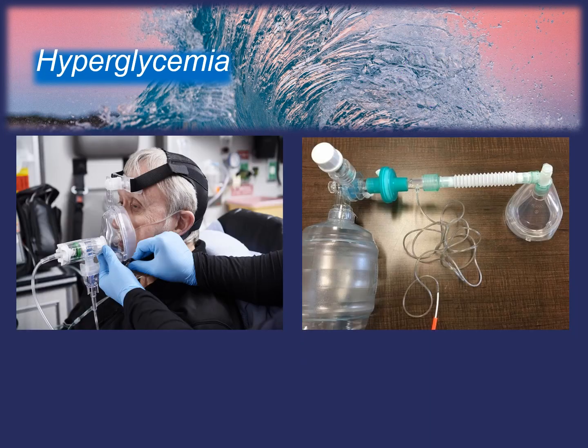Now, what if we have a patient that has a respiratory rate of 48 but an end-tidal of 7? Should we attempt to correct the patient to normal? Seeing a hypocapnic patient might make you want to jump in and intervene, but the key to successful management of these patients involves supporting intrinsic respiratory efforts.